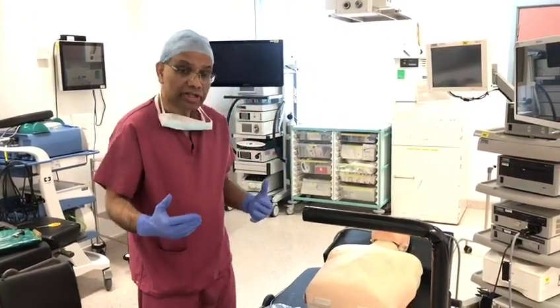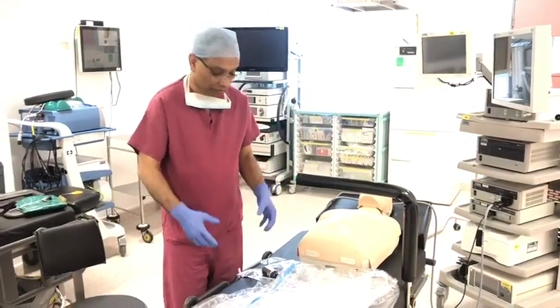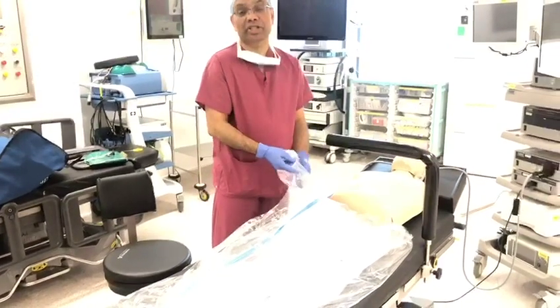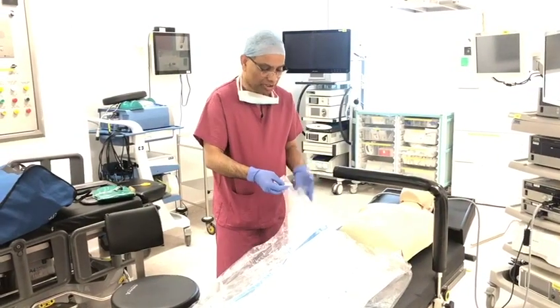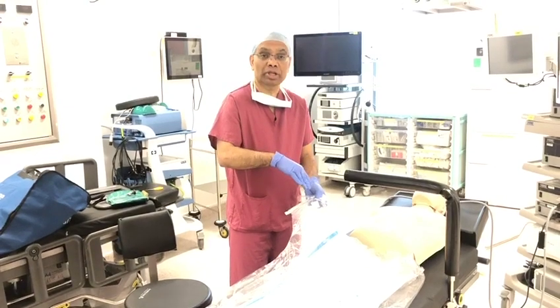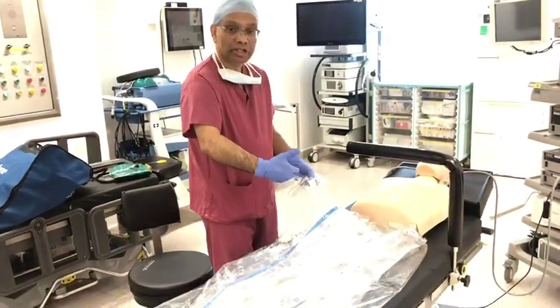We create a tent using a microscope drape. It has favorable openings to perform the endoscopic sinus surgical procedure. It has three eye-piece attachments. In one of these attachments, we make a slit which can be used to feed the light cable and the camera, where you can attach the endoscope internally.